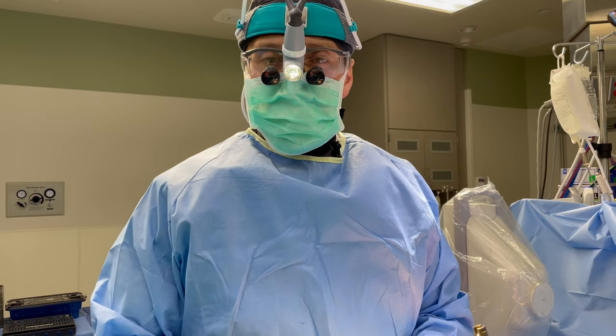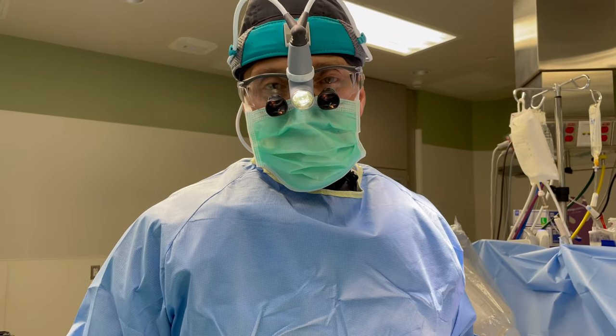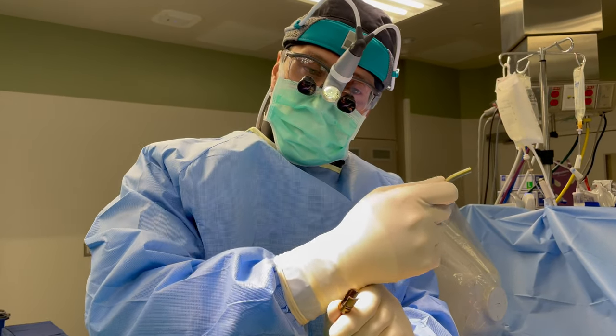Today what we're doing is we're reducing a spondylolisthesis. What that translates into in normal English is a slip in the spine where the bone has broken in the back and has allowed the spine to shift forward.